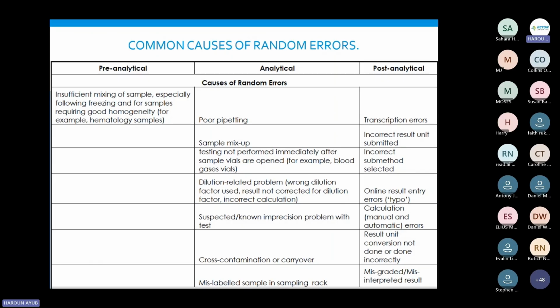So the most important thing about why we are doing the palm of the hand and inverting it 10 times is for you to observe on the bottom of the vial or the tube whether all the sediment has been mixed appropriately. When you invert it, you need to get a clear tube outline. Level 1 might not show much. Level 2 or the normal can have some, but with level 3 you'll usually find very dark sediment, so those cells are not sufficiently mixed.